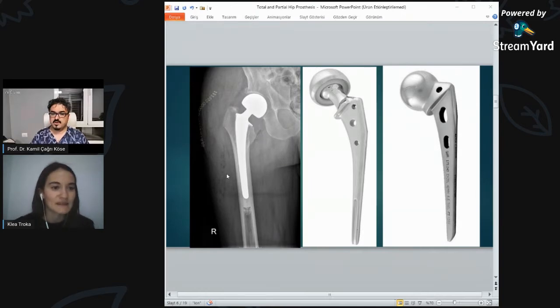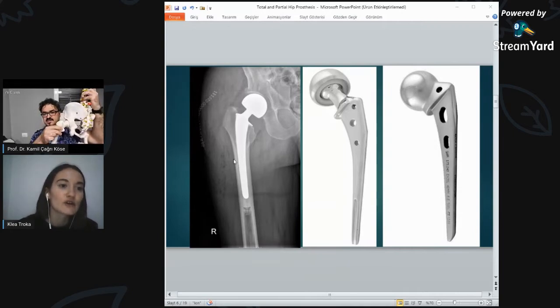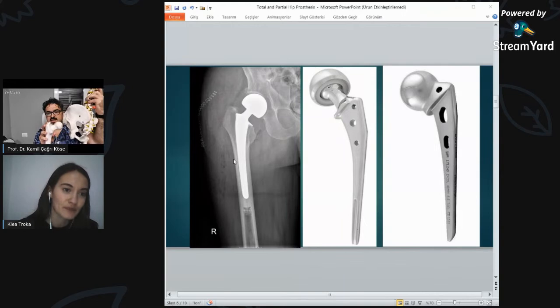Yes, Dr. Kamil. Okay. So, just to sum up the partial hip prosthesis, you can see this is the acetabular. Ai aty është acetabuli, është si shporta ku futet. This is the hip. This is how it functions. Femori që është kocka e kofshës. So, when there is a fracture here, pra kur kemi një frakturë aty te koka e femorit, we dislocate the hip.